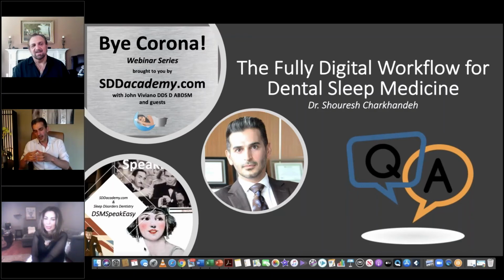However, you can test the patients at different verticals by choosing how deep their teeth are going into these temporary trays, or perhaps by adding these little inserts that you can make and not allowing them to go to the 4 millimeters. The Matrix trays are just about 4 millimeters away, but if you want to test them at 5 or 6 or 7, you can have them at those.